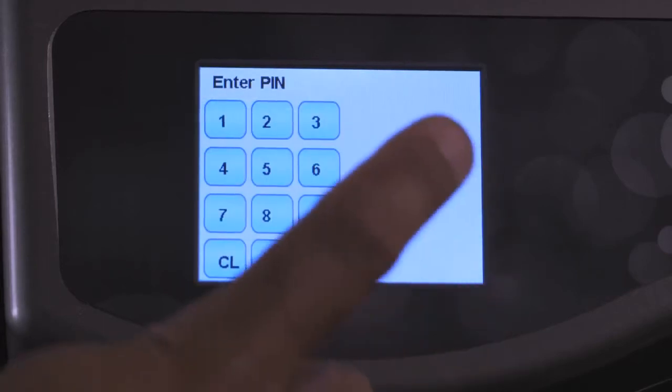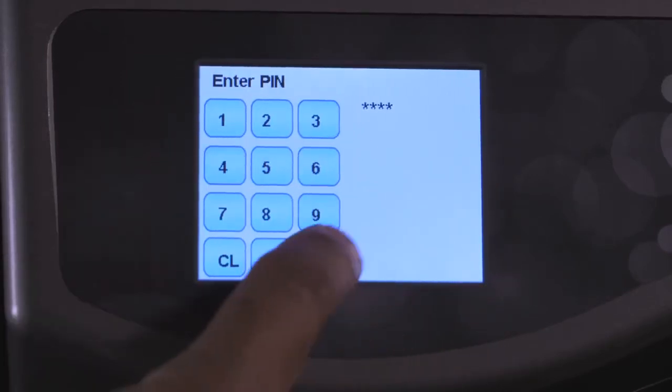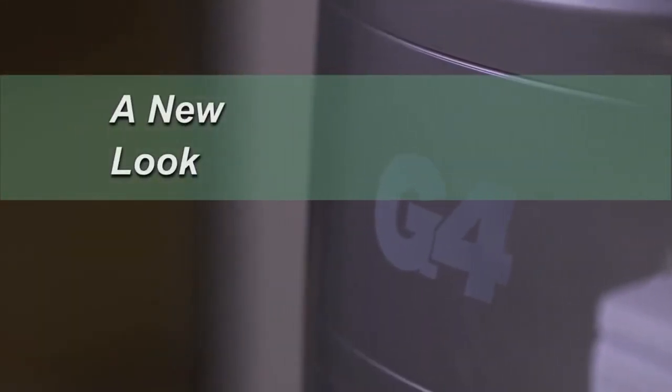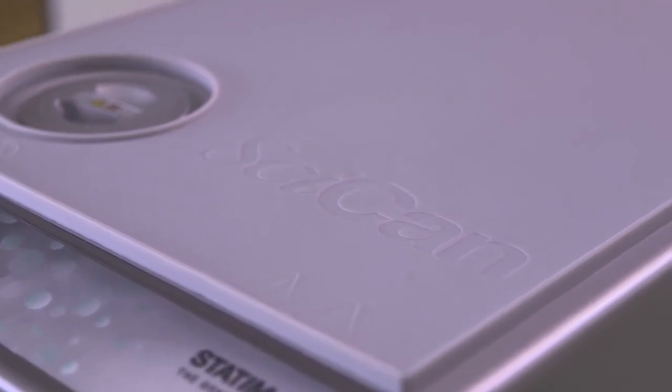The G4 also protects patient safety by a verifiable process that is PIN protected. The latest generation of Statum has been modernized with a new, sleek, and contemporary look. The G4 is complemented with an optional matching silicone stat mat to protect and keep the unit looking brand new for years.